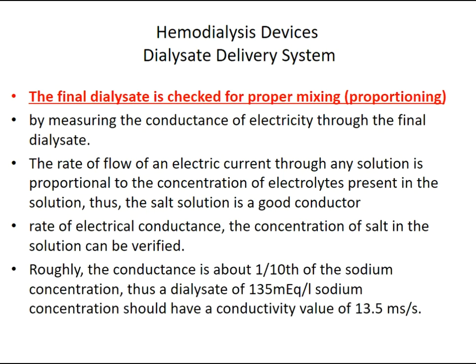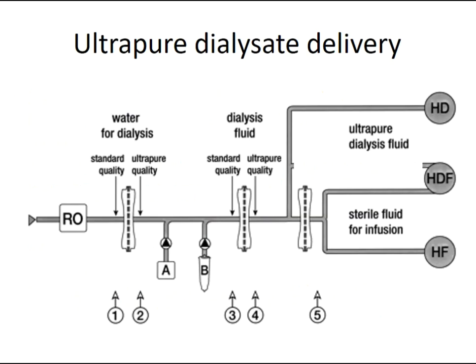Roughly, it could be estimated that the conductance is about 1/10 of the sodium concentration. Thus, a dialysate of around 135 milliequivalent per liter sodium concentration should have a conductivity value of 13.5.